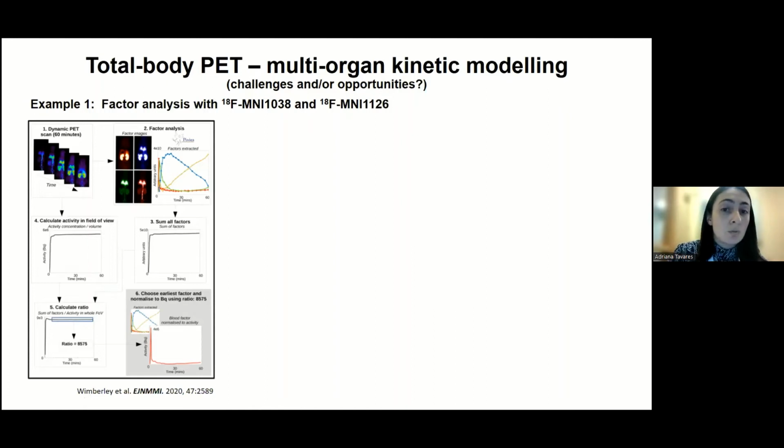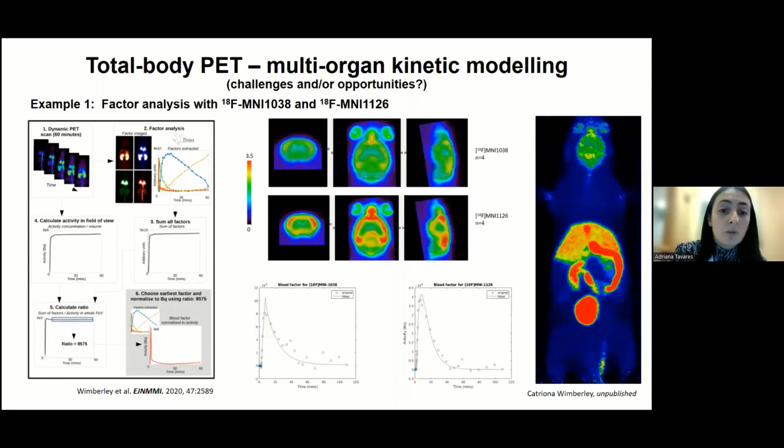So one of the things we want to eliminate is the need for all of that instrumentation that you've seen on the slides before, and instead have just the PET scanner, just imaging data without the blood collections, and just being able to derive the same kinetic outcomes by using the image data. And being able to use the information on the vascular pools from the imaging data to do those corrections. And we think we can do that quite well.